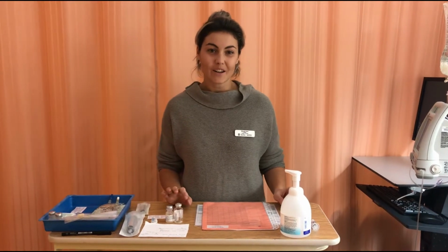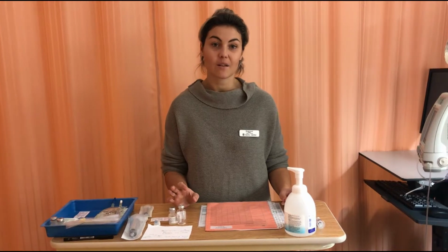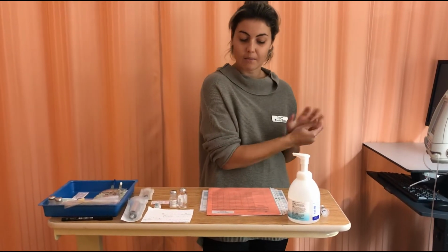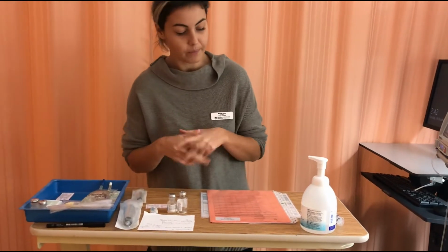Hi there, my name is Miranda Under and I'll be demonstrating how to reconstitute an IV medication and administer it through the CIVA pump. So I'm going to start here with just a little hand hygiene and then my first med check. So I have penicillin here.